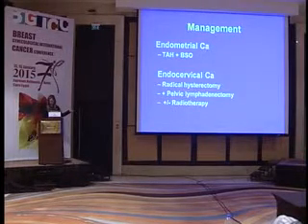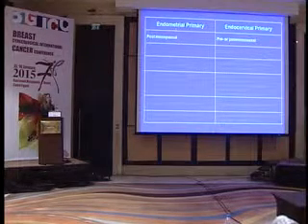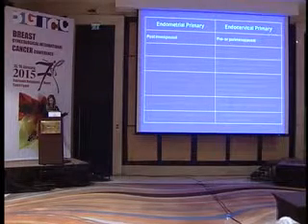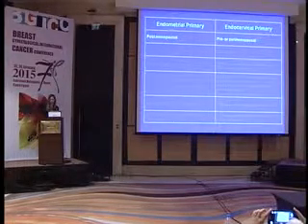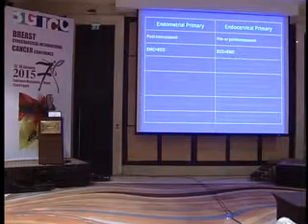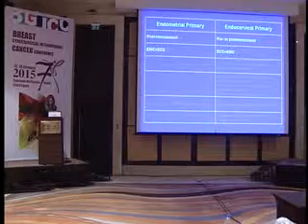This is why I thought I'll give you this little table. It's the age of the patient. In the endometrial primary, the patients are postmenopausal. In the endocervical primary, the patients are most of the time premenopausal. You'll get it more in the endometrial curettage than ECC. It's the opposite in the other one.